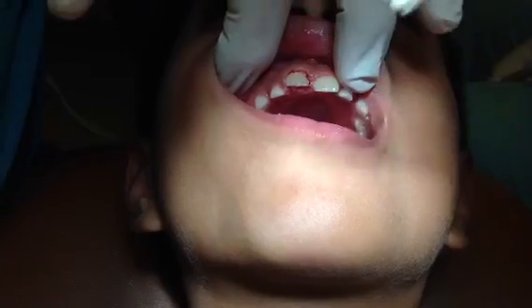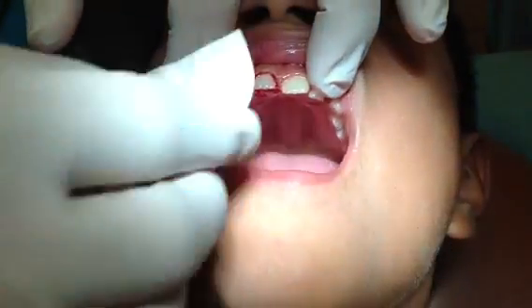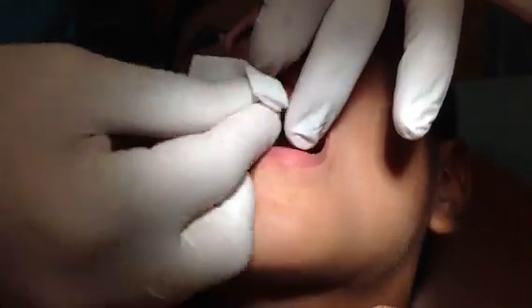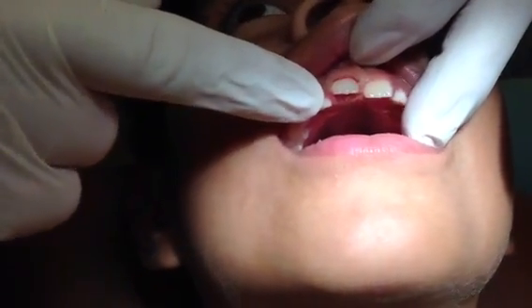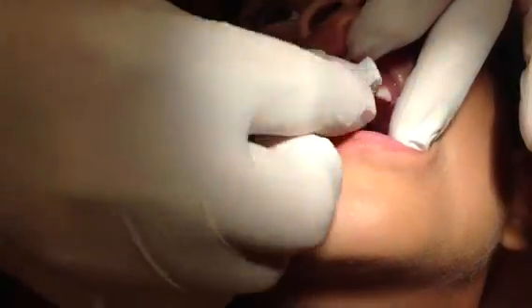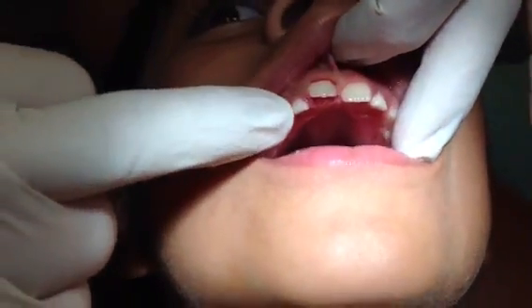Patient underwent surgery, no bleeding. Step up there. No bleeding. Come on back, you could see. And did you feel anything? No. Excellent. Tooth is now exposed, has room to grow, and we will do a follow-up in about a week and a half to 2 weeks, and he should be good to go.